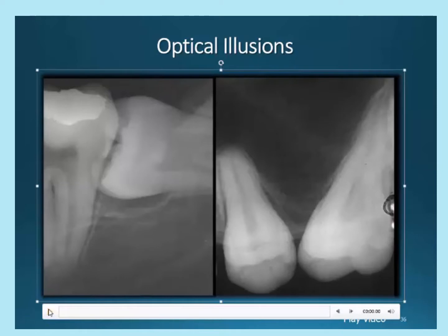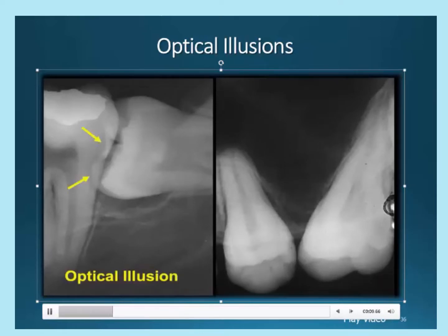First, when the images of two very dense objects are superimposed, the image of one appears to be outlined with a radiolucent band. This radiolucency does not represent a loss of tooth structure, but instead is an optical illusion. Second, two objects physically in contact will appear to be separated by a radiolucency. This is referred to as peripheral burnout. This is evident because the narrow point of contact between the objects allows more X-rays to pass than the adjacent thicker regions of teeth.